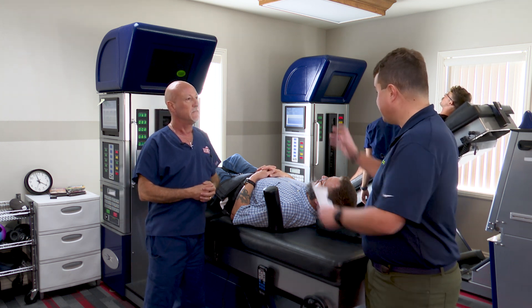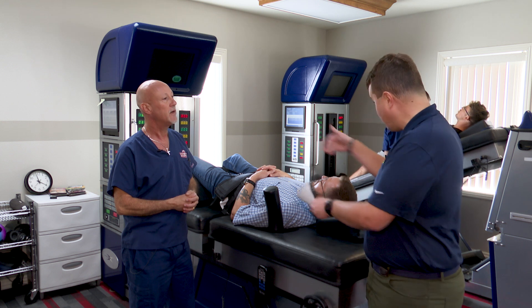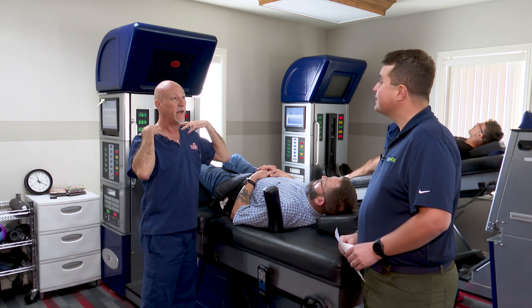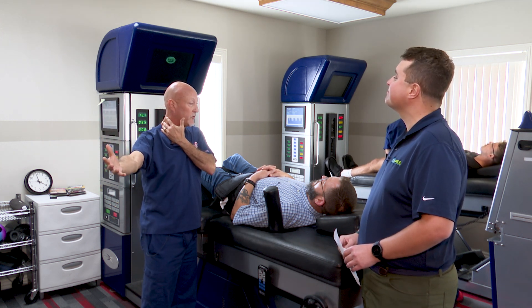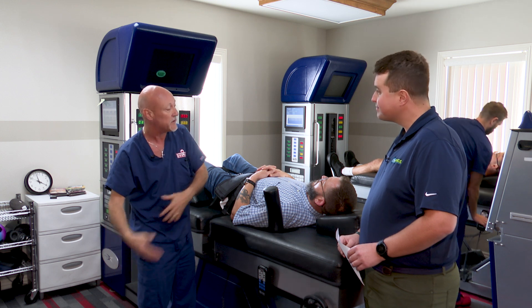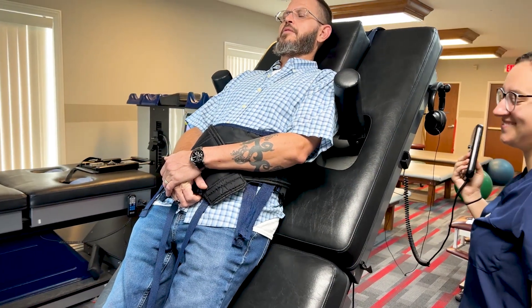What I love about this machine is I'm seeing a lot of bells and whistles, but it's actually something that's pretty relaxing for folks. So how does this work? Well, we can isolate two areas. We can isolate the neck — all the nerves coming out of the neck totally control your arms. So when you get pressure on the nerves in your neck it will go down your arms, and if you get pressure on the nerves in your low back it goes down your legs. With this machine we can isolate the neck or the low back.